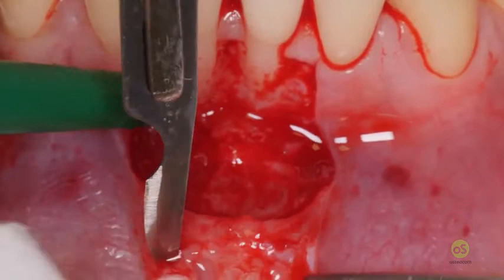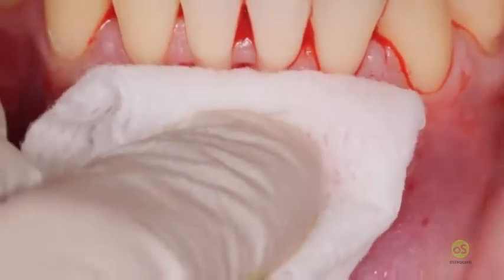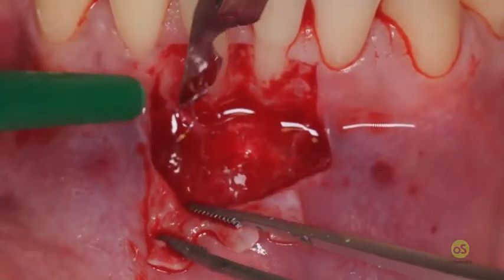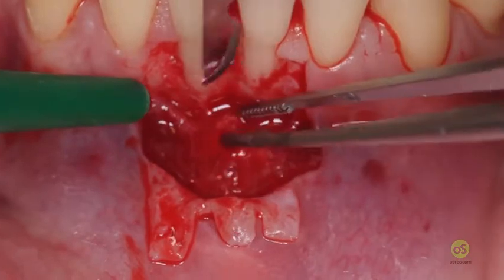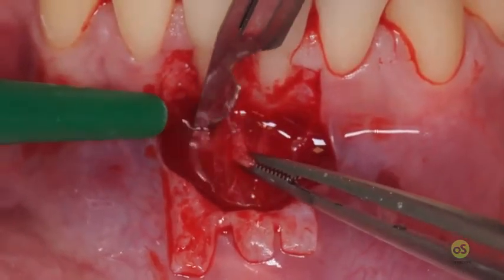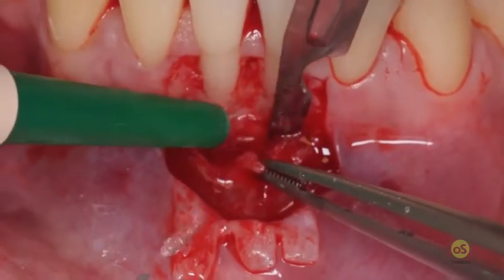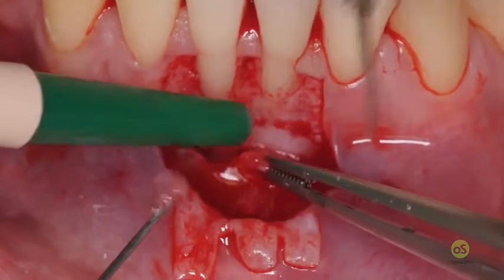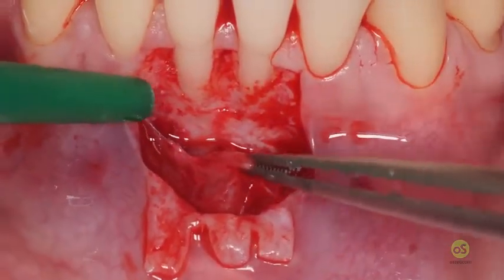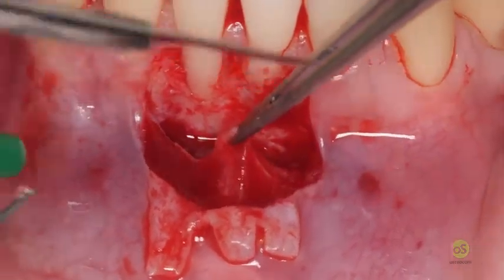Now that the flap is ready, you see that the muscles are still there. So what I have to do is to get 5 millimeters of periosteum apical to the root exposure, free from these muscles, being able to attach the flap to this area of periosteum that is just free.